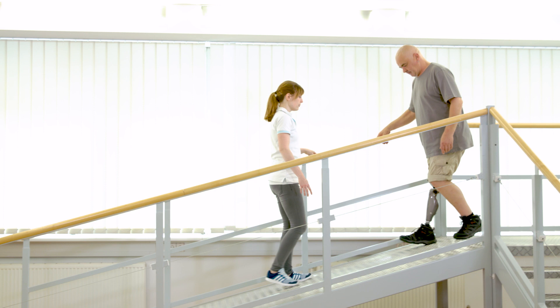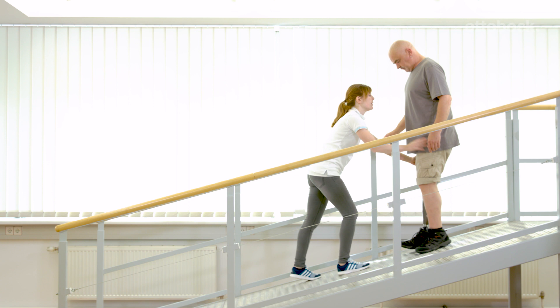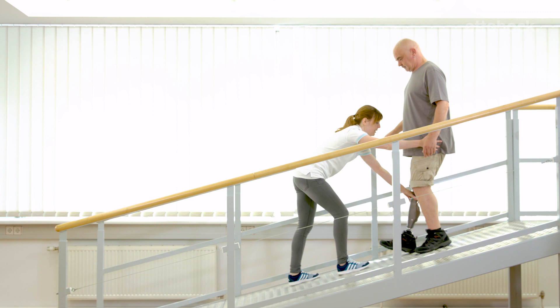Gerhard pushes the residual limb into hip extension which impedes adequate knee flexion and alternating steps. Franziska reminds Gerhard to maintain an upright body position and to keep the centre of mass over the foot. This helps Gerhard with the right timing for knee flexion.